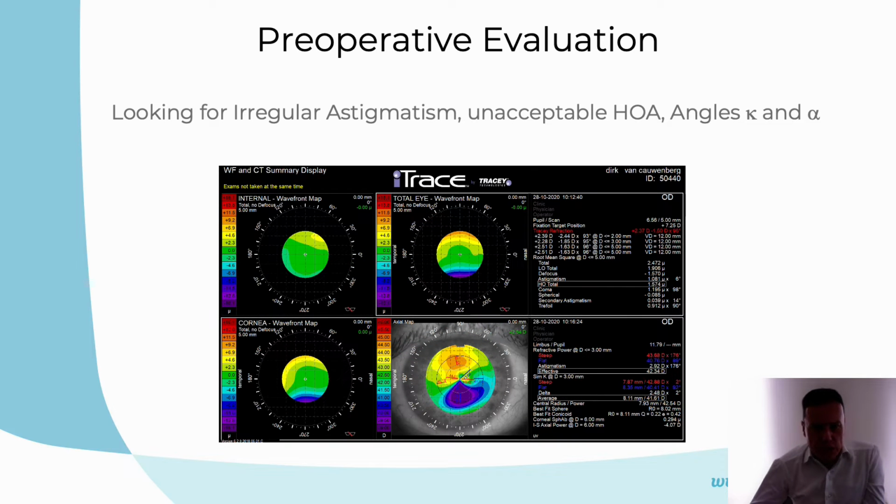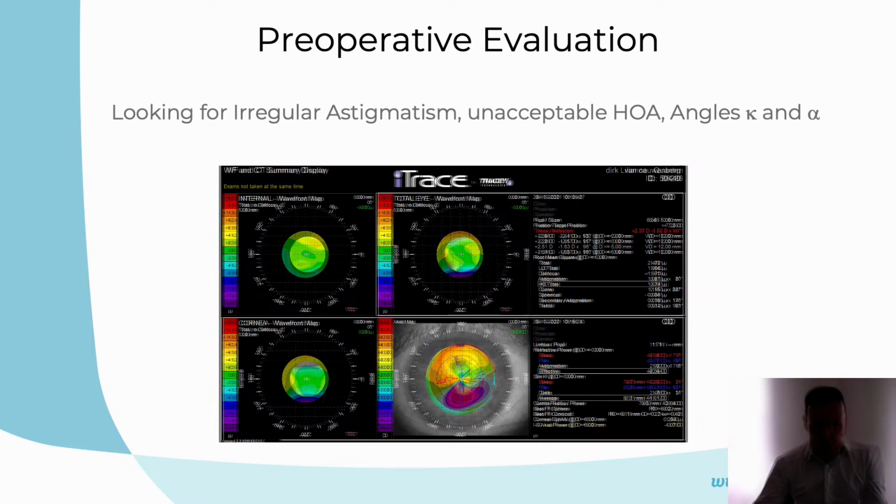Another example, this is with the eye trace. Here again, in the pupillary zone, the changes are enormous. And when we look at the coma here, of course, we find a huge coma, which is an absolute red flag for implantation of a high-performance IOL based on trifocal design.